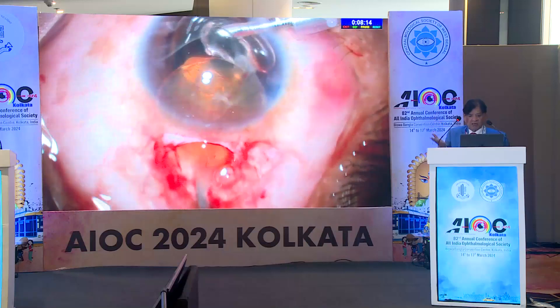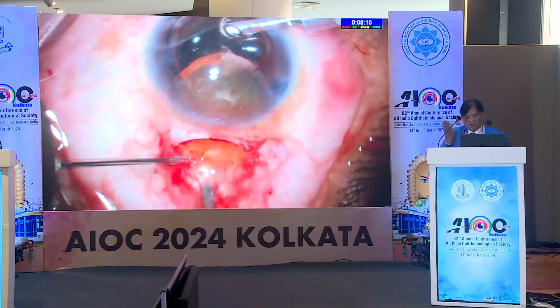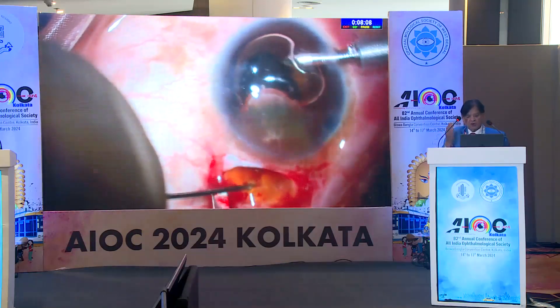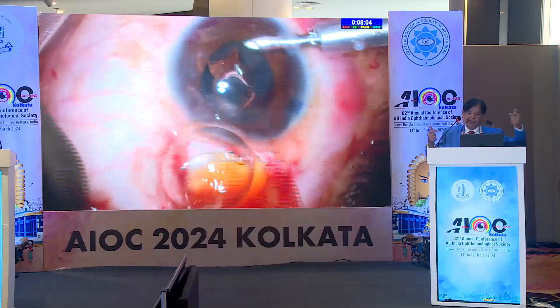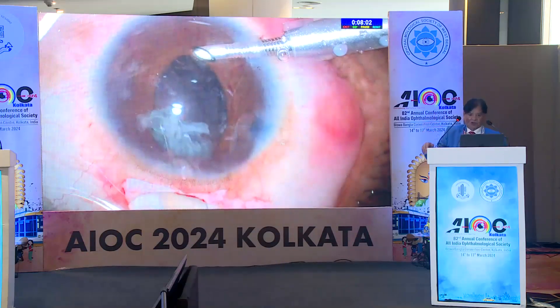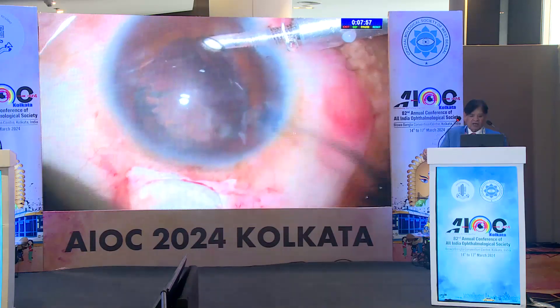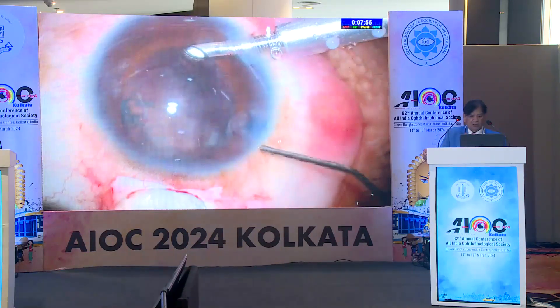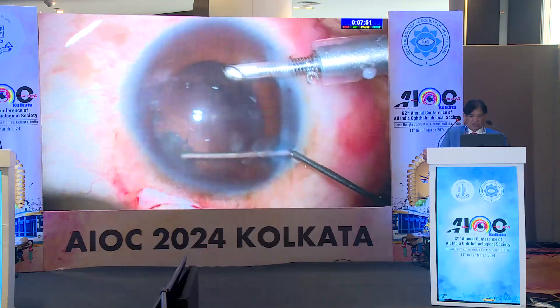You may have slightly less glide, but I have learned to do it with an iris repositor. As soon as the nucleus shows in the mouth of the incision, I insert a needle and wheel it out. You can see that such a big black cataract has been taken out through a small area.